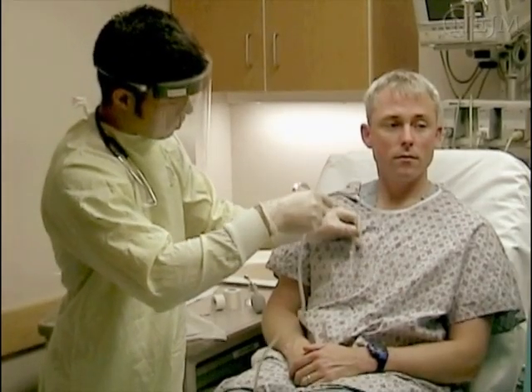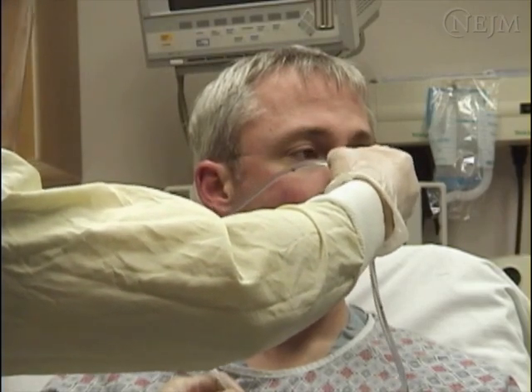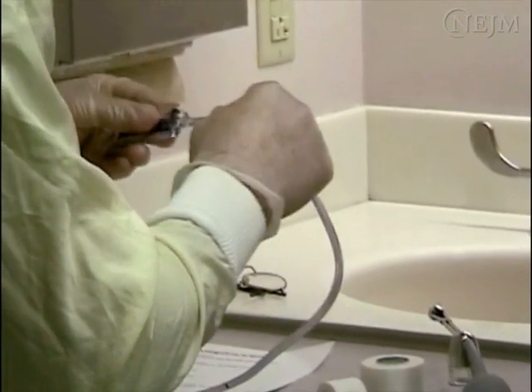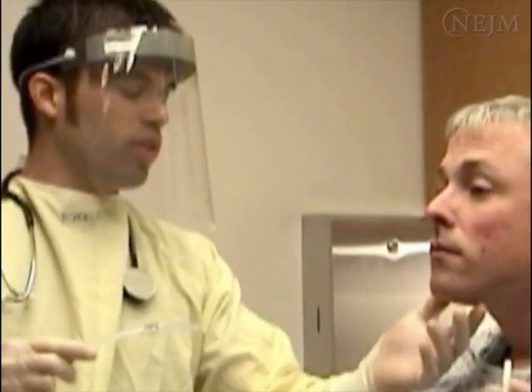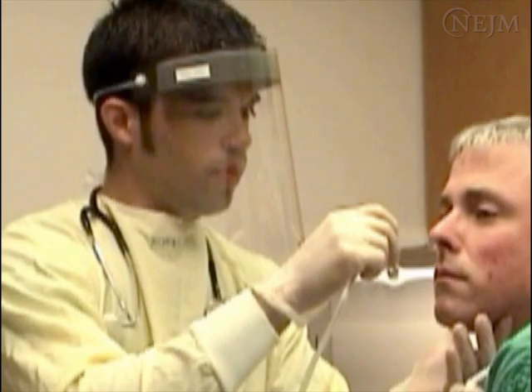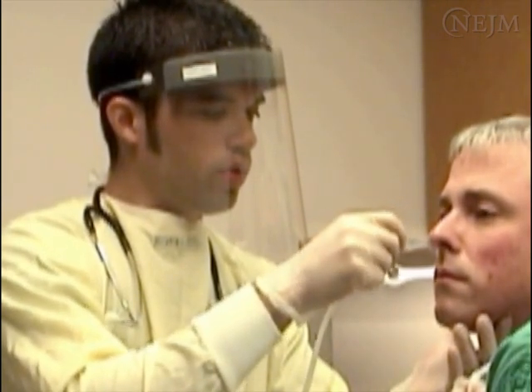The proper depth of tube insertion is approximated by measuring the distance from the xiphoid process to the angle of the mandible and then to the nostril. Lubricate the distal tip of the nasogastric tube with surgical jelly or viscous lidocaine. Position the patient sitting upright in the sniffing position. Insert the tip of the nasogastric tube into the nasal cavity and slowly advance it posteriorly parallel to the floor of the nasal canal. The tube should not be directed upwards.